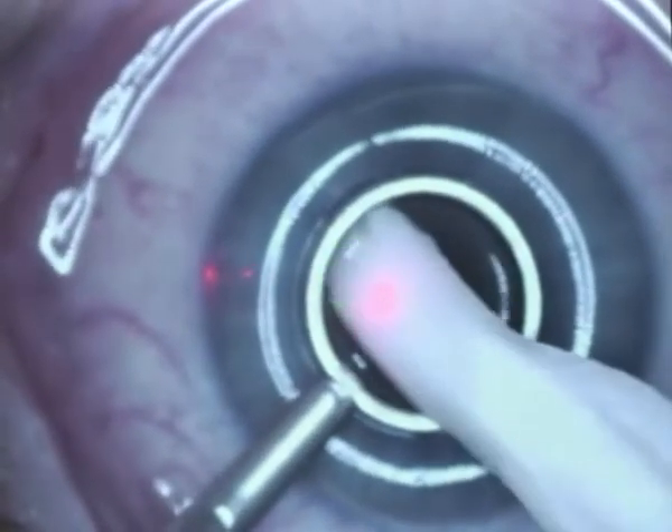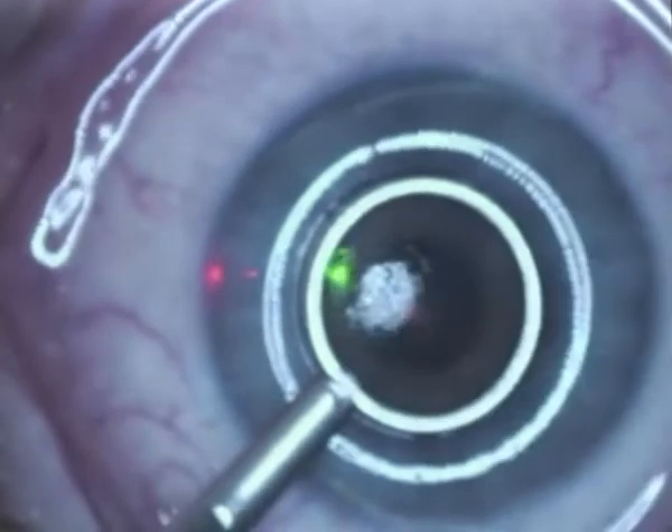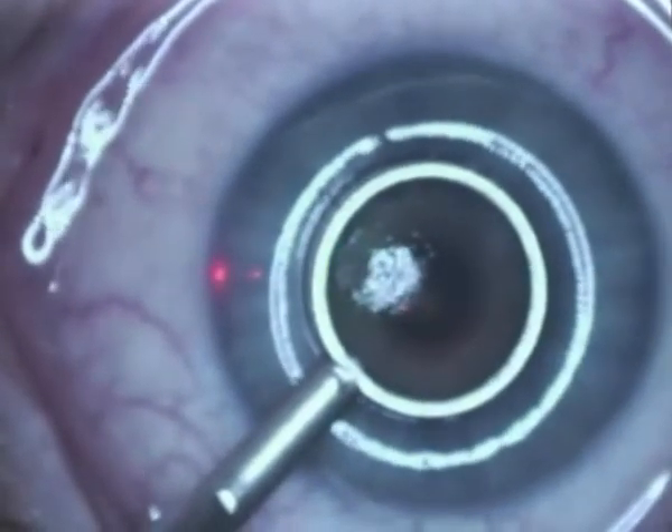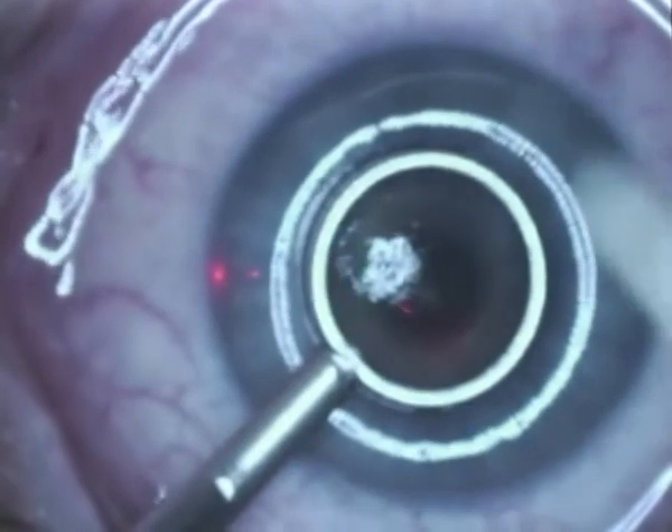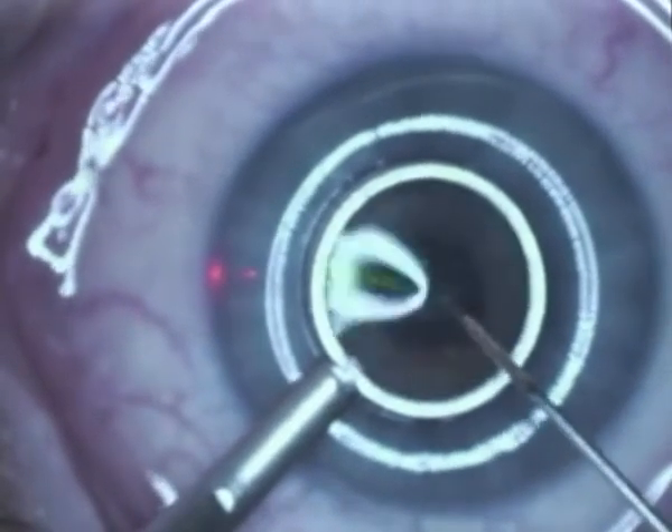The alcohol is absorbed using a sponge, and cooled BSS is instilled into the well in order to dilute and soak up the remaining alcohol.